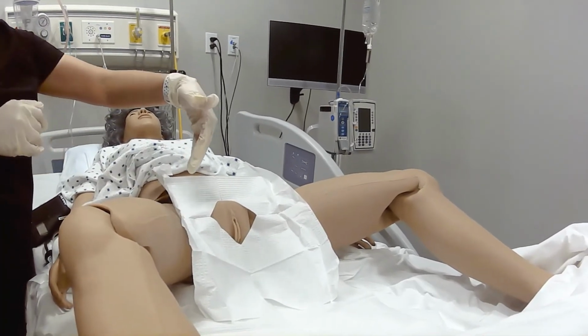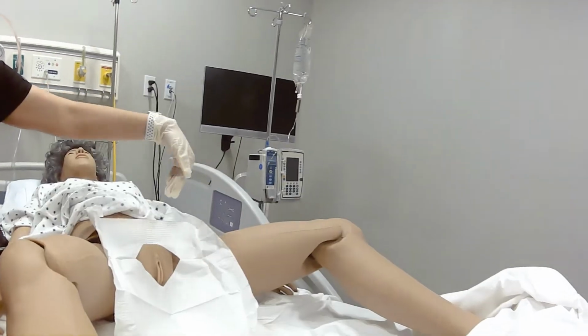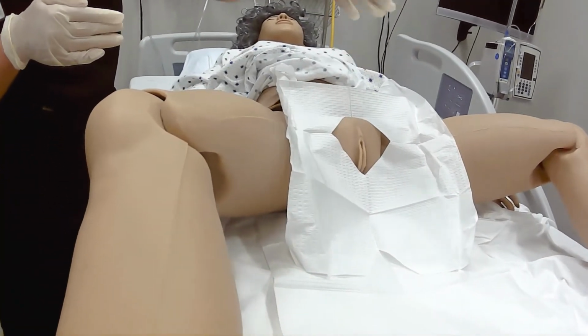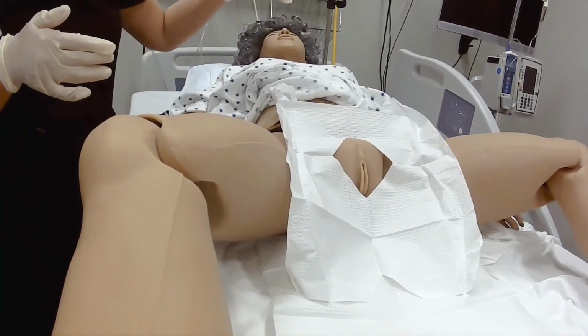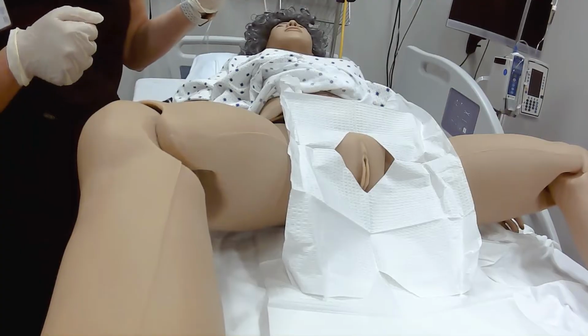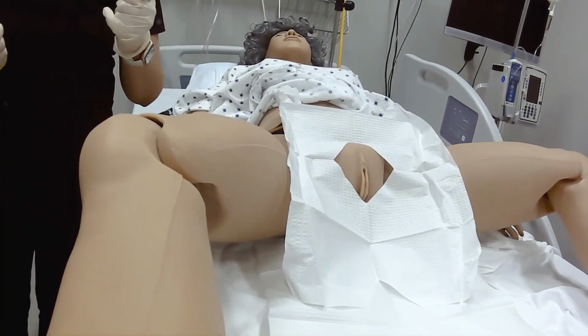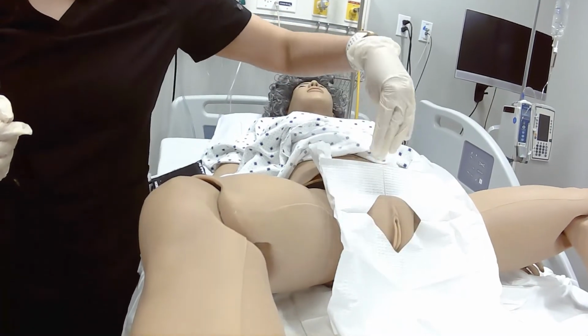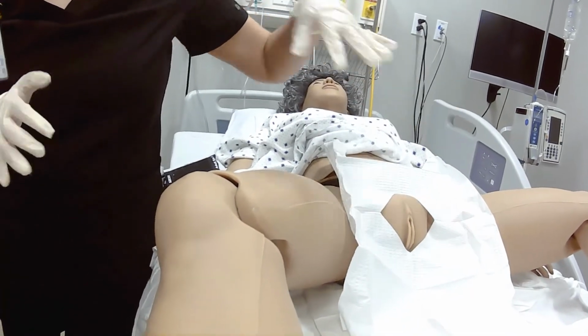So you want to make sure that you don't touch the bottom of this fenestrated drape, because it is now not sterile, because it has already touched the patient. You also need to avoid touching the 1-inch margins, because they are not sterile, if you need to make any adjustments. But just try not to touch it as much as possible.